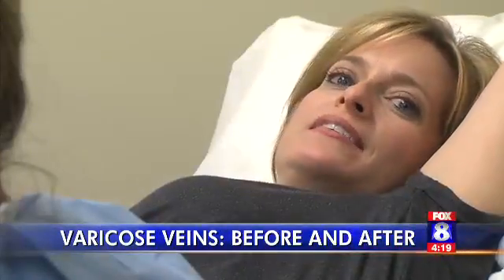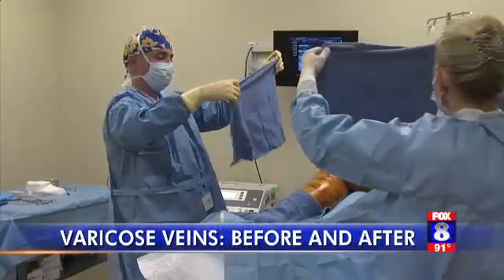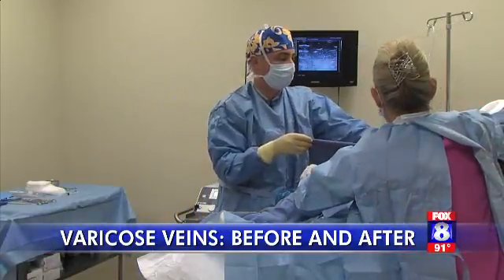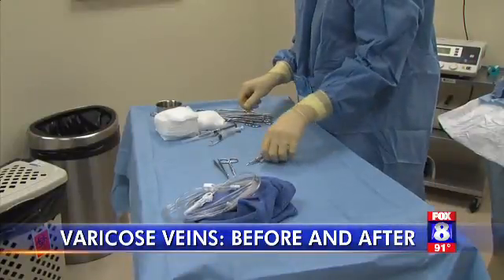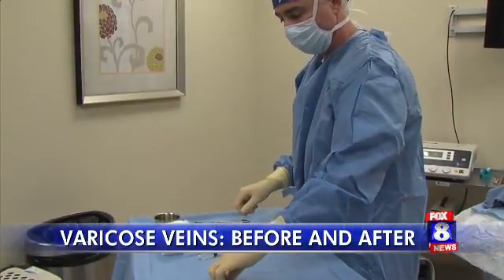I'm feeling no pain, no discomfort, nothing. It's really quite incredible knowing what's going on. The ClaraVein procedure only takes about 30 minutes. Then Dr. Greenberg starts on my lower leg.